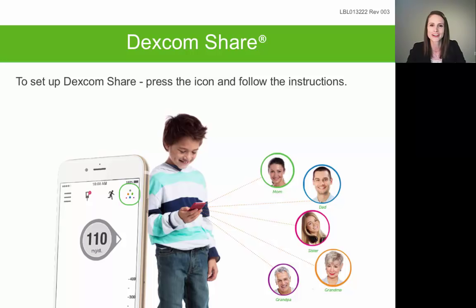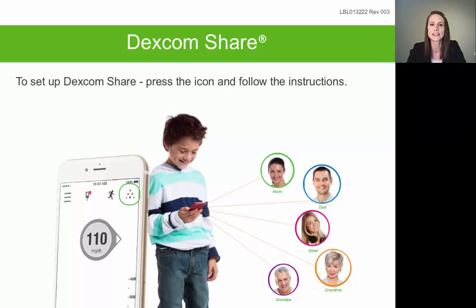One of the last things we'll discuss today is Dexcom Share — exciting technology that allows the patient to share their glucose information in real time with up to five loved ones or family members called followers. Followers can view the sharer's glucose information at any moment and be alerted when glucose is too high or too low. To set up Share, click the triangular icon in the upper right corner of the G5 app home screen, provide your follower's email address, and an email invite will be sent that expires within seven days. Your follower opens the email on their smart device, downloads the Follow app, and accepts the invite. Share is only available on a smart device because both sharer and follower need an active internet connection.